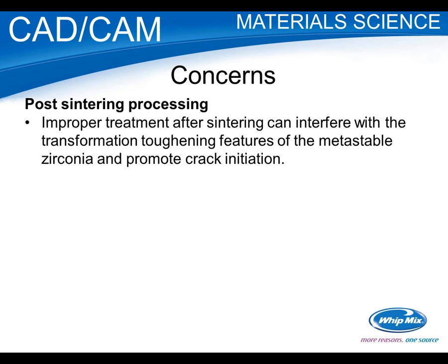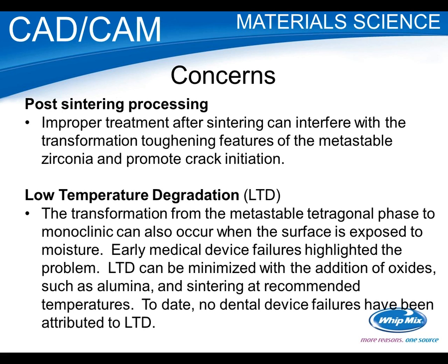You don't want to heat it. You need to use a water-cooled diamond burr. Think of when I showed that picture, that little model where we applied a stress and the tetragonal crystallites converted to the monoclinic. Well, that only happens once. It's like a match. Once it's lit, you can't light it again. And so once you've done that, you've already taken away the magic, so to say, from that part of the restoration. So you need to be careful in how you process it.